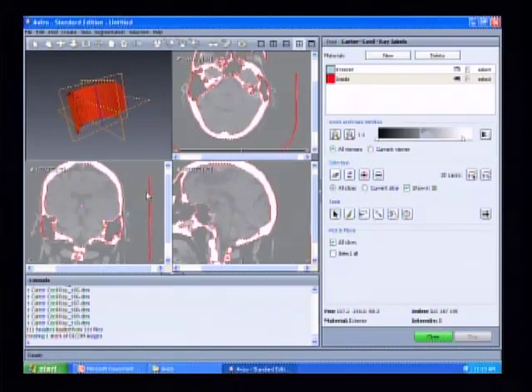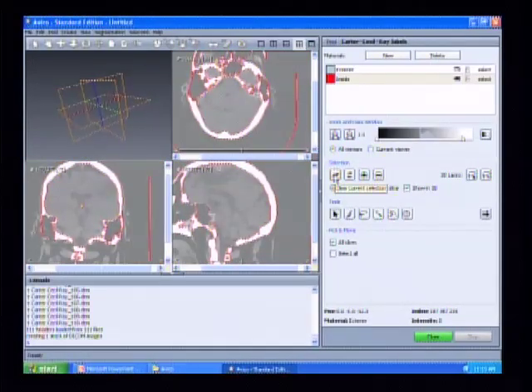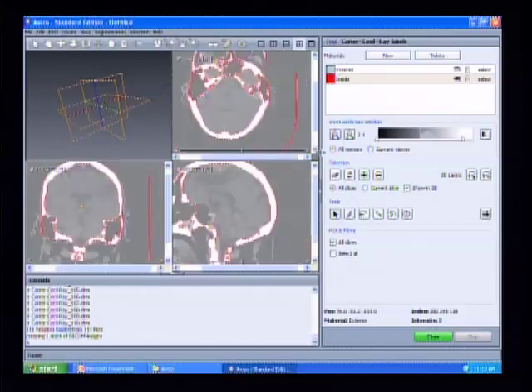If you click outside of the red line, it's just going to highlight the rest of the material in the background. If that happens, you can just hit your eraser button again. And if you have to zoom in or move around, you can do that as well. You want to select this background so that it highlights, and you know you're accurate when that whole little semicircle appears in the top left. So did everybody get that?